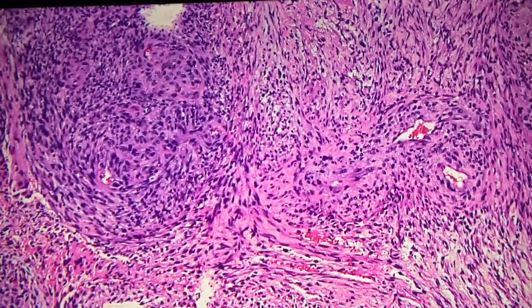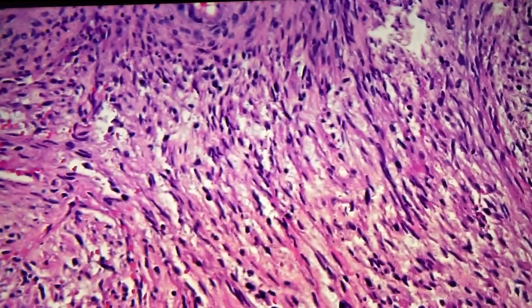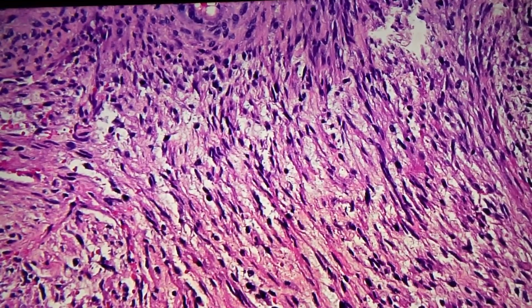See that down there? There's sort of a looser looking area. Yeah. So this is a gliosarcoma. It's kind of a subtype of glioblastoma. So Gabe was right. Yes. Amazing. These guys are super smart. I know, you guys are doing awesome.